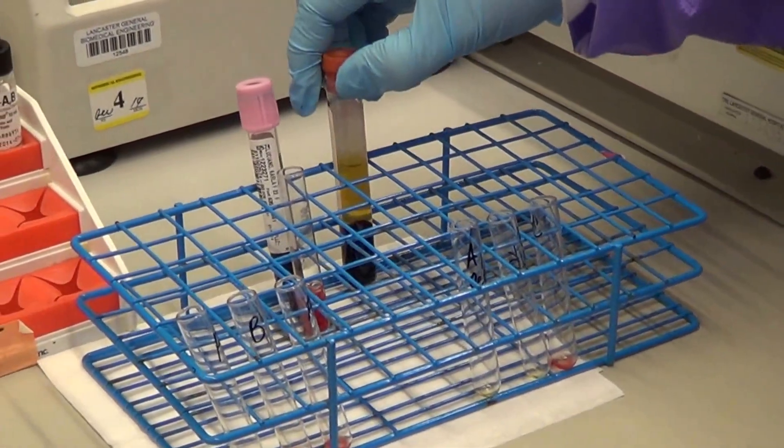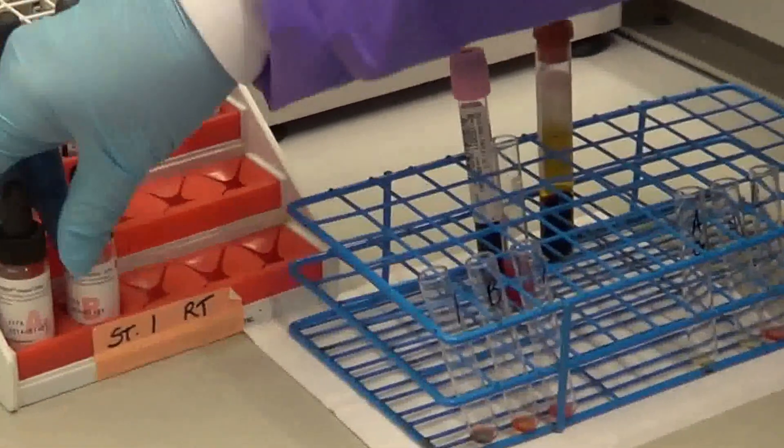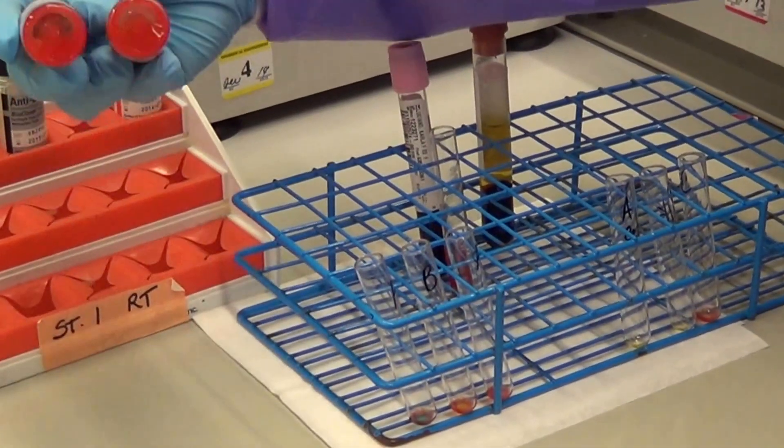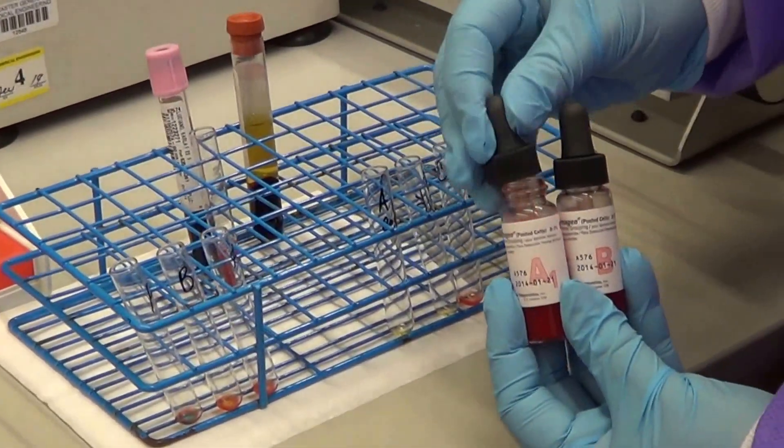You then add your reagent A and B cells. You add one drop of A1 cells, and then one drop of B cells.